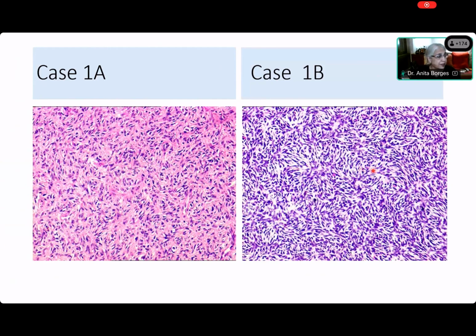The right-sided picture, that is 1B, is more obviously storiform than the left. But every single one shows you a point there, and you can see the point. Let us see if I can get some points to come up over there. All right, I'm going to mark the points from which all this storiform is coming up. Okay, there is the point.